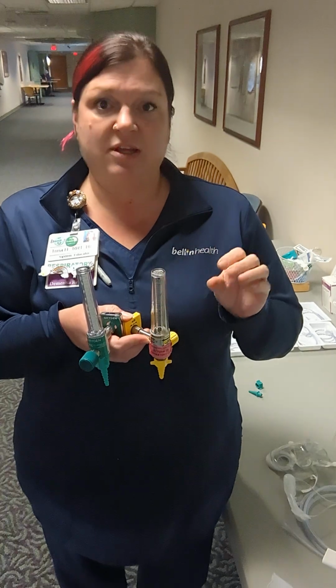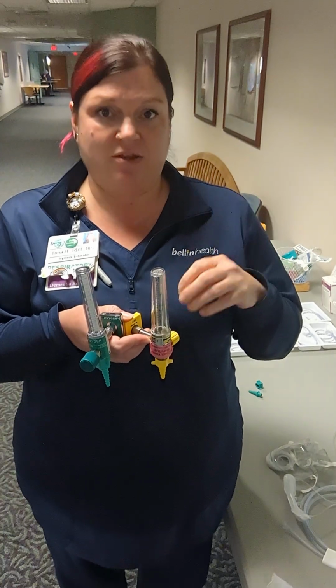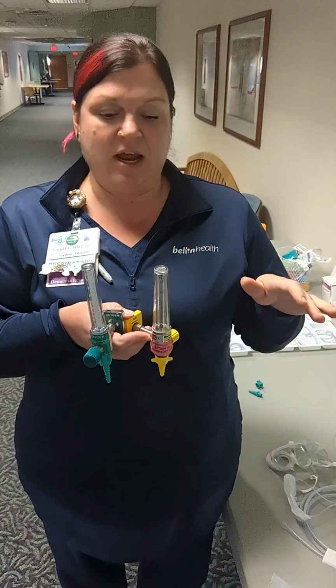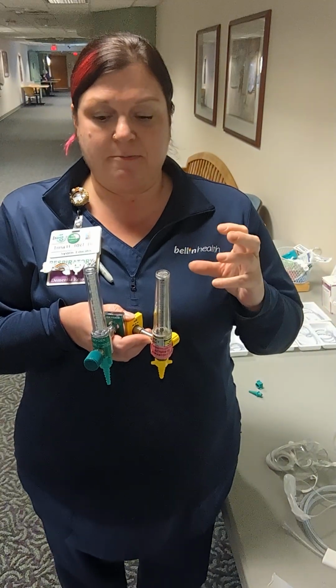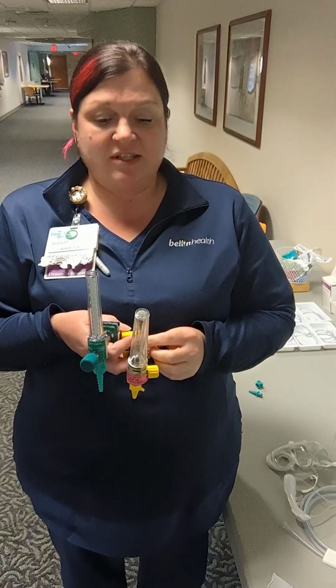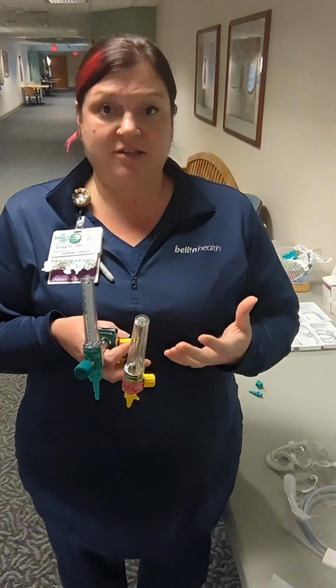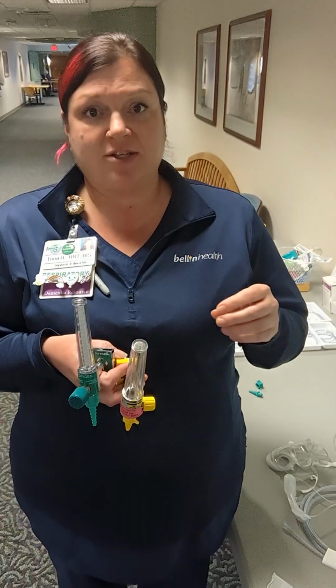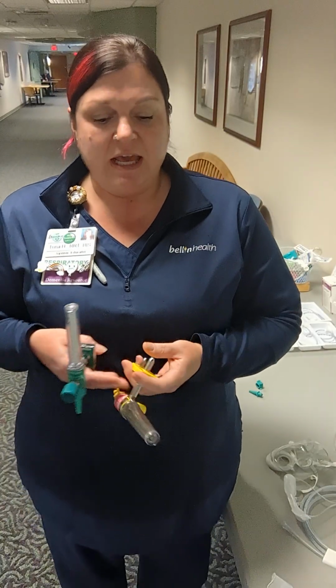So 1 liter per minute, 2 liters per minute, 3 liters per minute. That's measuring the flow that is coming out of these devices. And so when we're discussing the oxygen concentration, we use a term called FiO2, fraction of inspired oxygen.